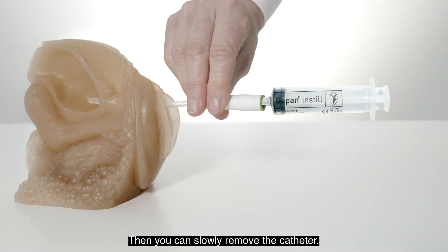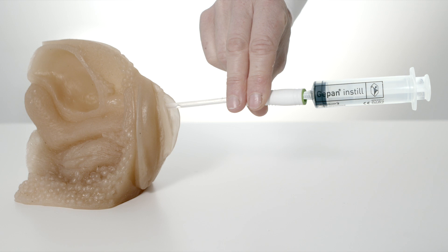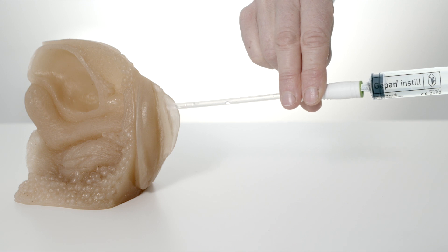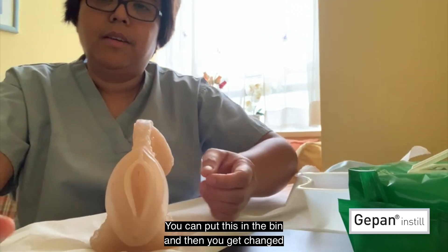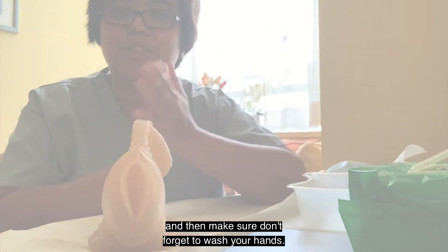Any urine that drains, let it drain until it is completely empty. Then you can slowly remove the catheter. Put it in the bin, then make sure you don't forget to wash your hands afterwards.